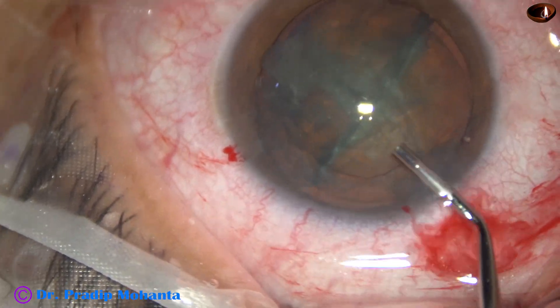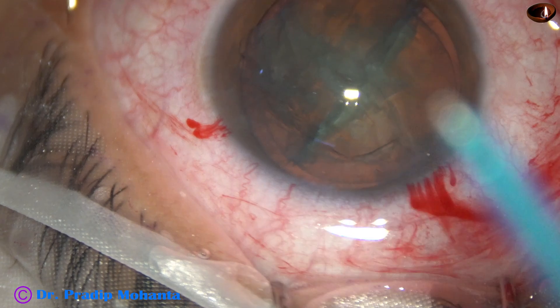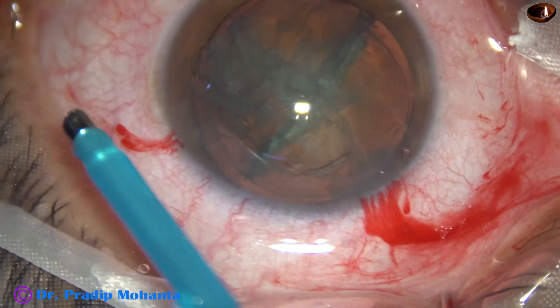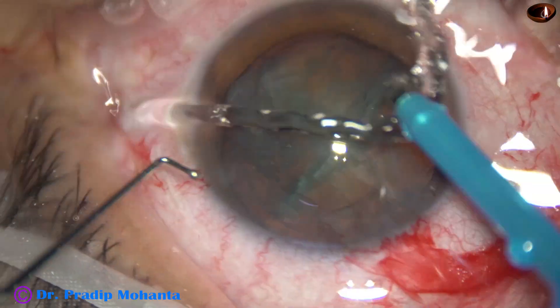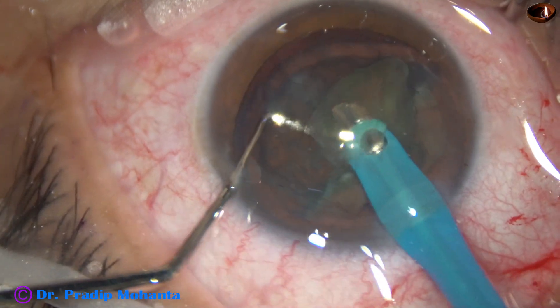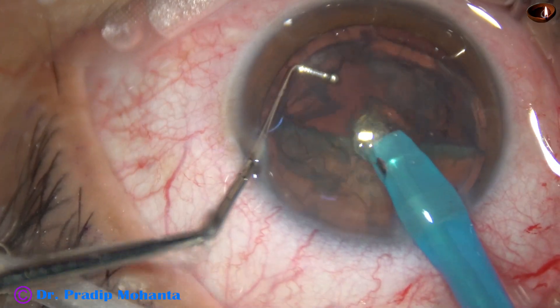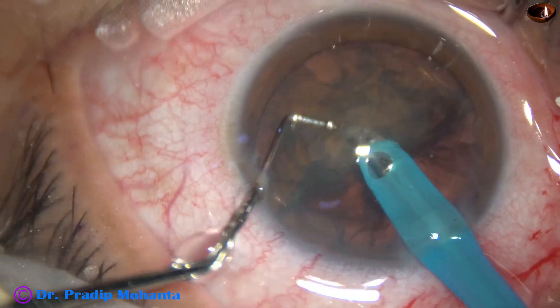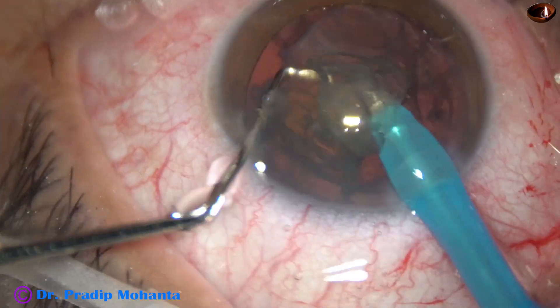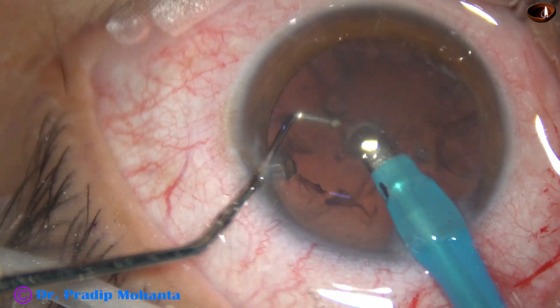Visco again. Now is the time to use the phaco handpiece to remove the nuclear pieces. The handpiece goes beveled down. One hemi-nucleus is picked up and it is emulsified, then the other one. The hemi-nucleus is turned, it is pierced at its belly and it is conquered in a few seconds. The nuclear shell is removed.